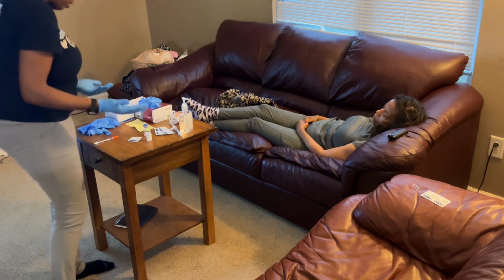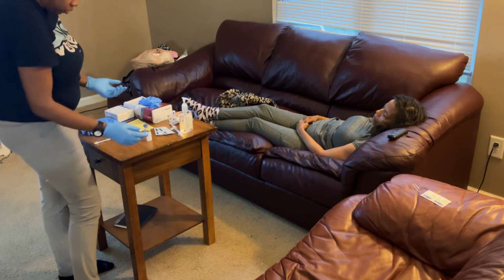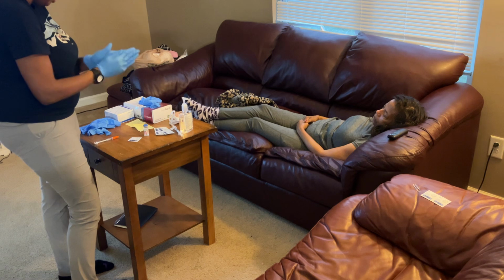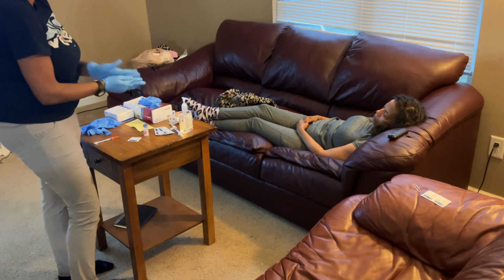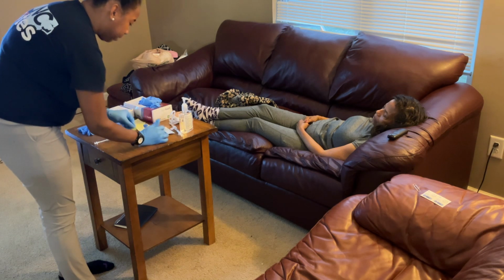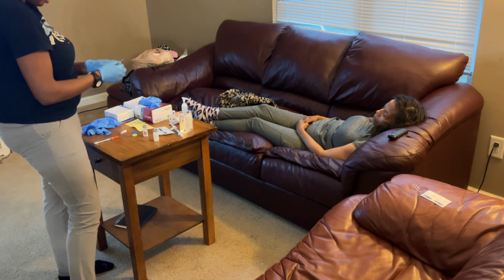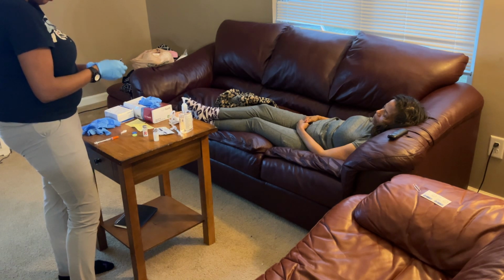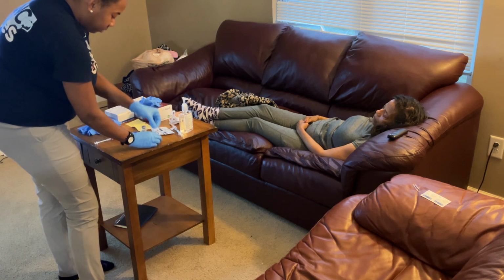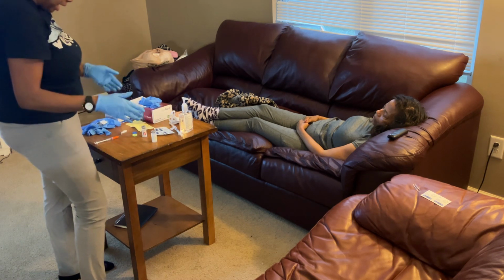All right. So now I'm going to begin preparing my medication. I need to roll my cloudy. I'm going to roll my NPH. Okay. I'm going to take off my caps. I am going to clean my valves, sterilize my valves. I would turn it to another side and dispose of that.